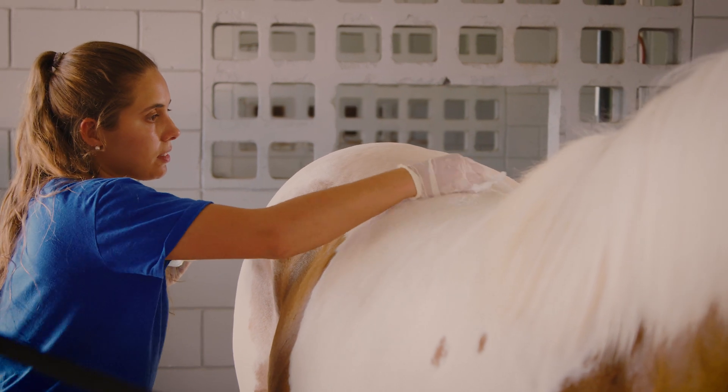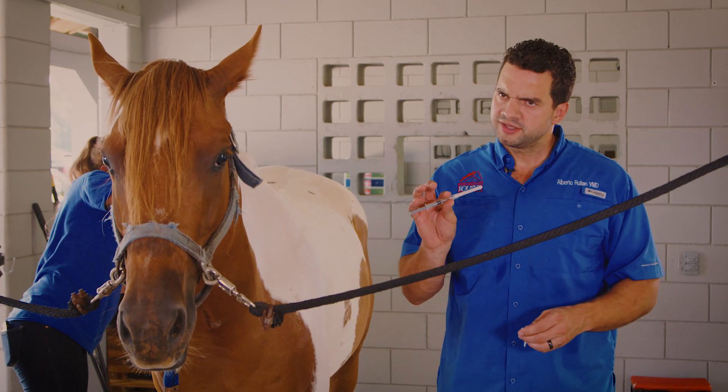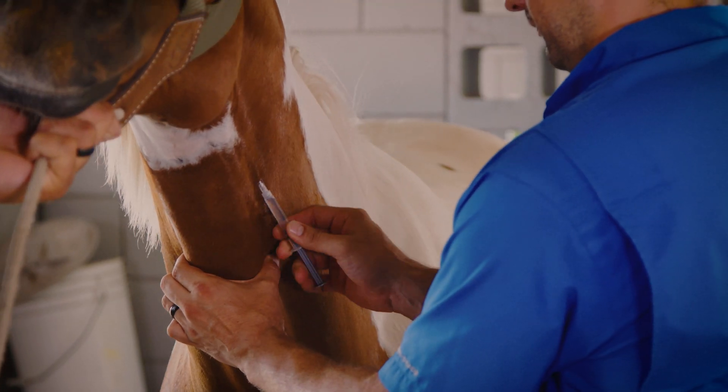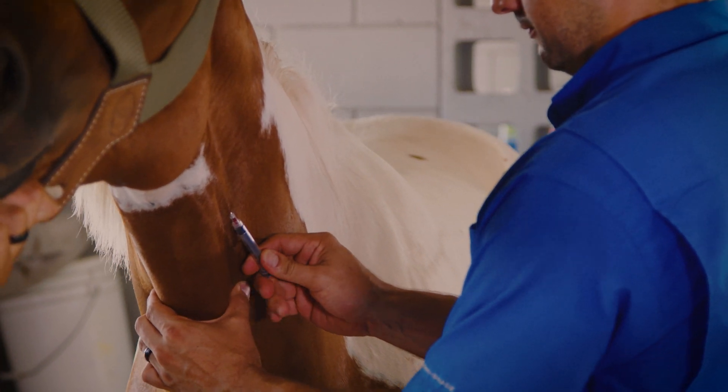The first thing we do for the sacroiliac joint injection is a sterile preparation — this is a very important step because an infection in any joint could be lethal. This procedure is a little painful and horses tend to react a lot, so they jump up and down or they buck. So the next step is we actually give them a little bit of sedation.